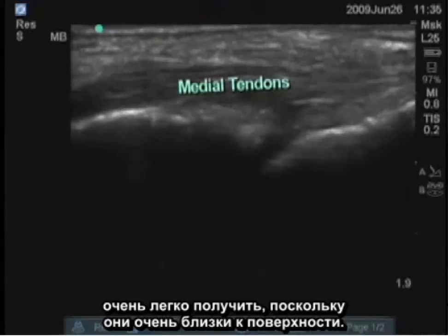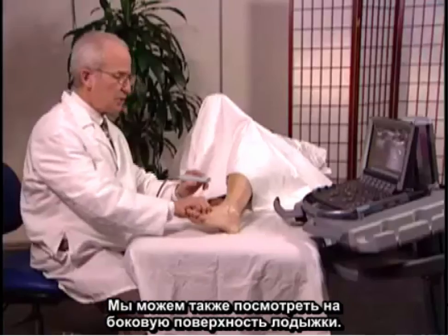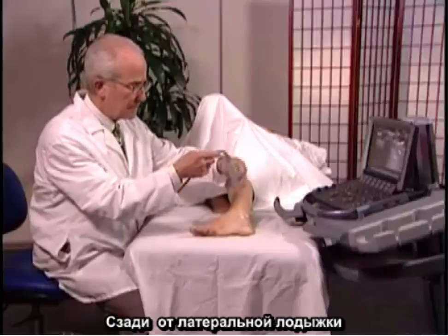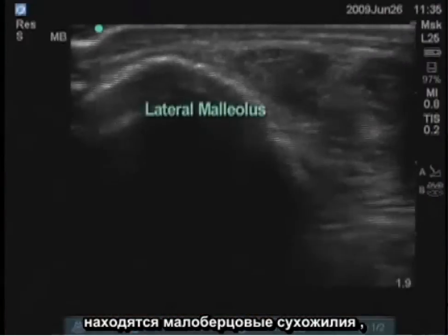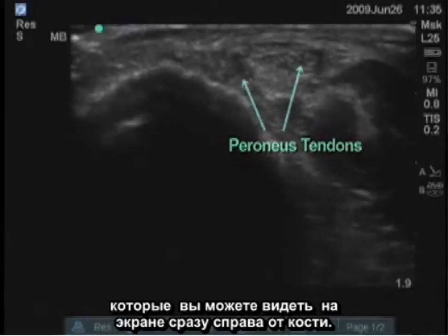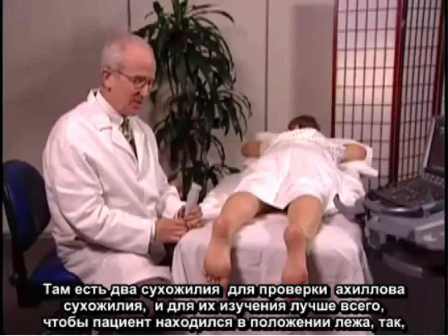A longitudinal image of those tendons is also very easy to obtain because they're so superficial. We can look at the lateral aspect of the ankle where the peroneal tendons are present, just posterior to the lateral malleolus. You can see them on the screen just to the right of the bone — there are two tendons there.